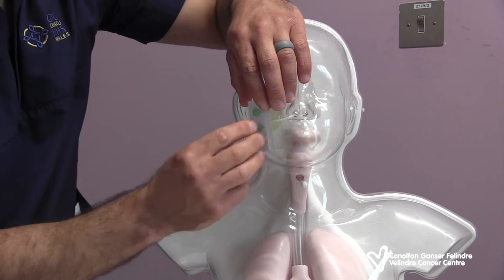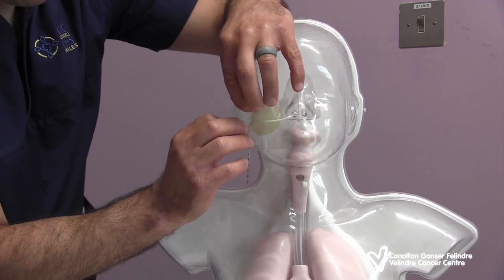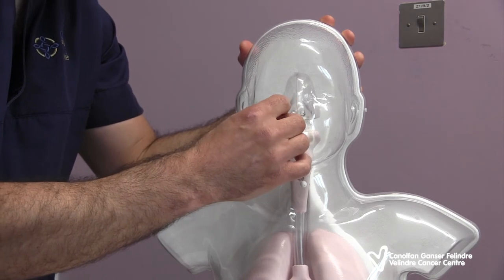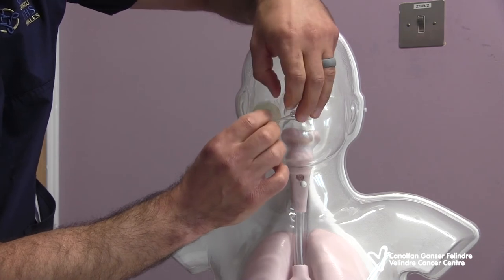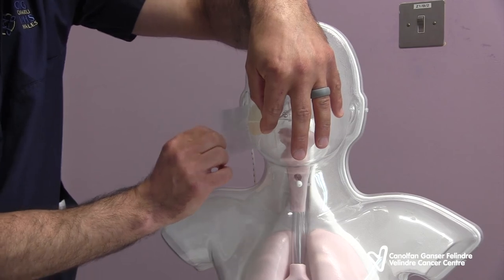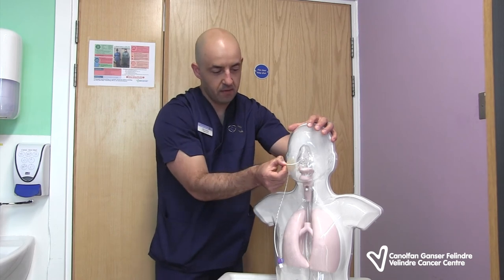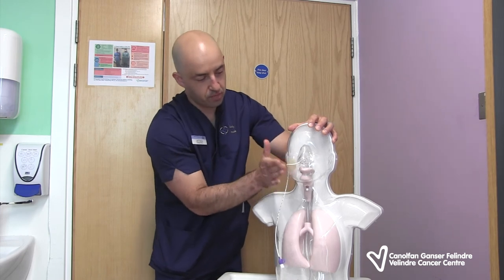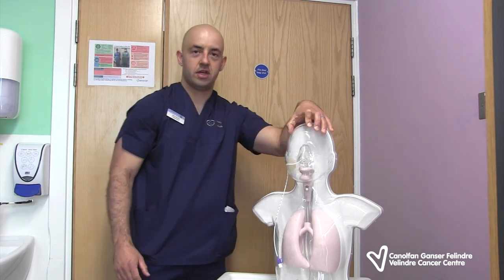Here is the number two part of the dressing. So you pull that back and off and then secure the remaining part to the cheek. And then you take off the third part of your dressing. This can be a bit fiddly, so just take your time. And then secure it and then pull that back. And then what I do is run your fingers, or get a family member to run their fingers, along the NG tube and then just push down on the dressing itself. And that's how you change the nasogastric tube dressing.